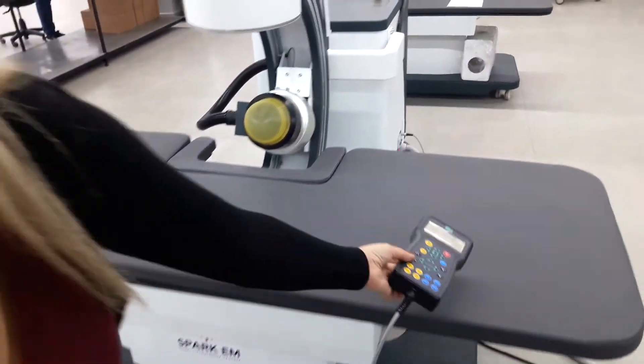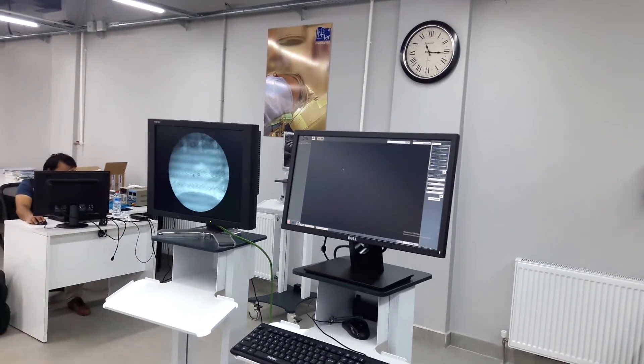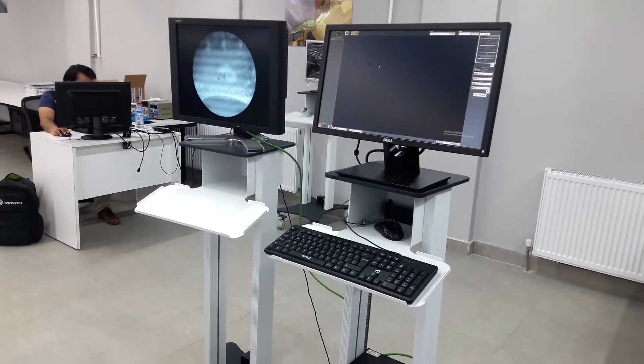Spark EM has this computer imaging system. If you prefer, we can also offer this medical monitor in addition to the system.